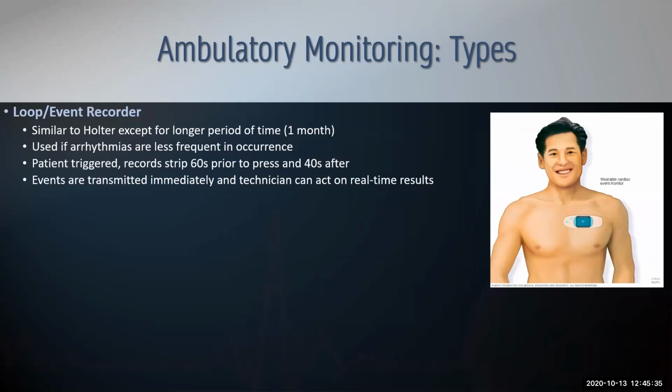So the patient triggers it, and it records a strip for 60 seconds before and then 40 seconds after.